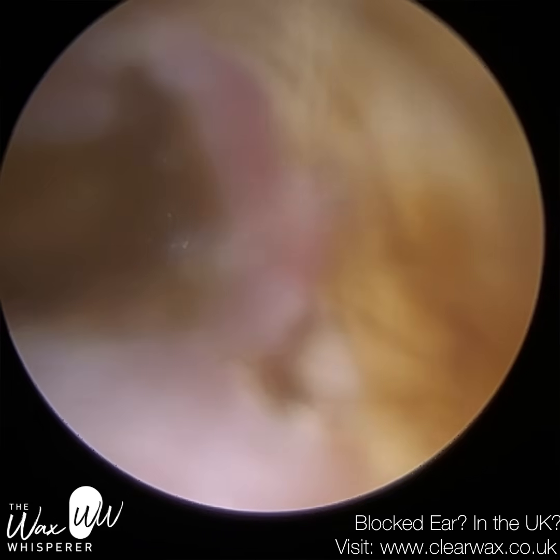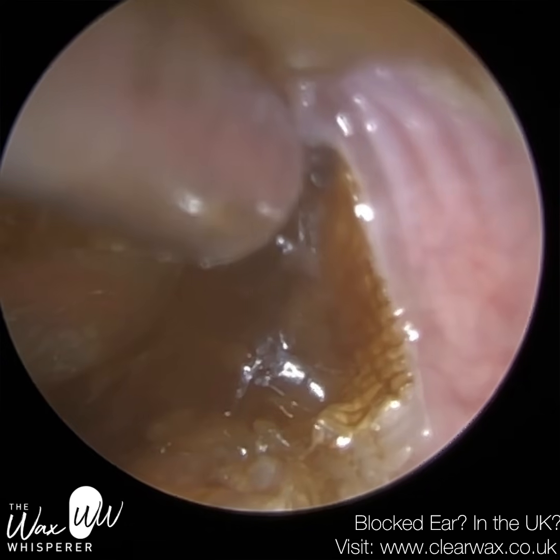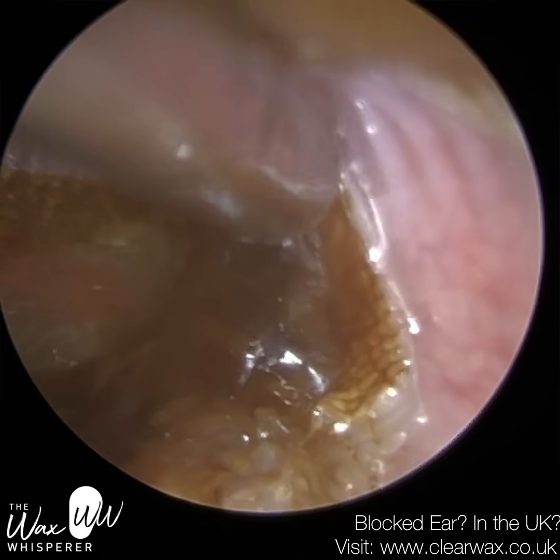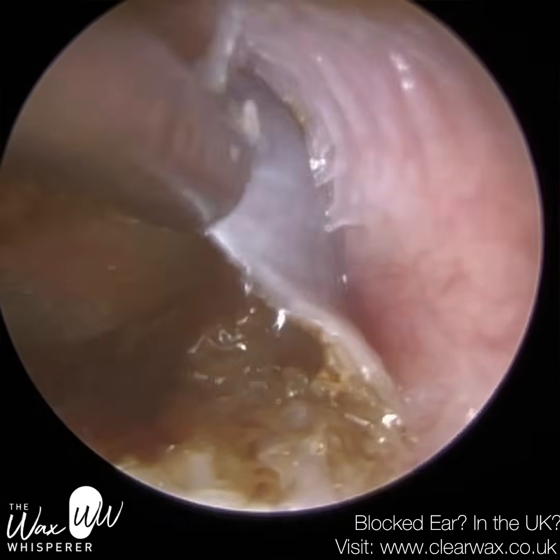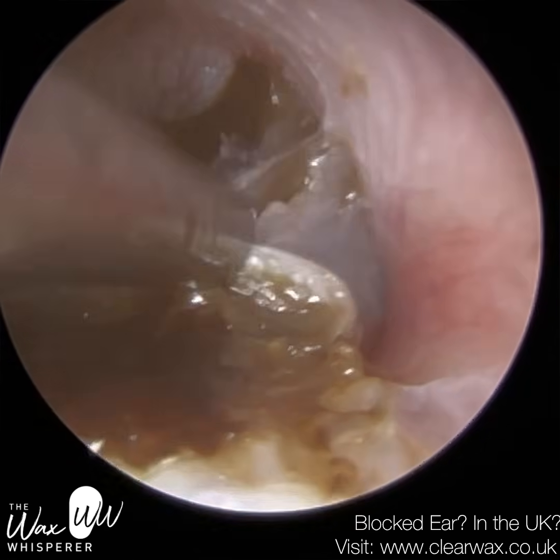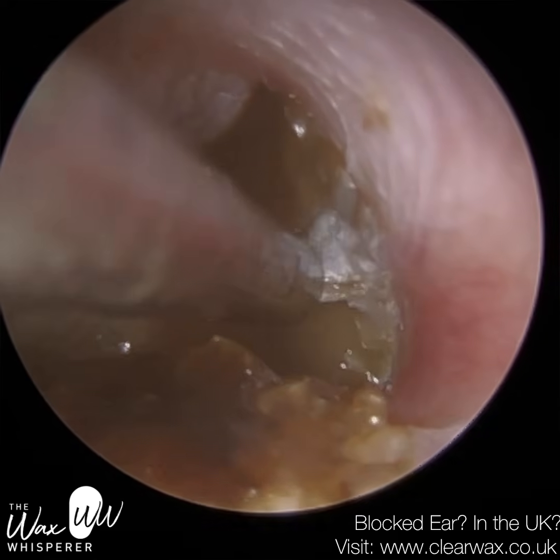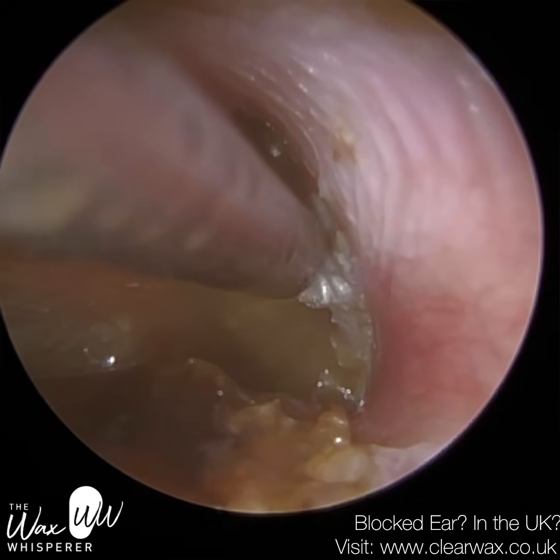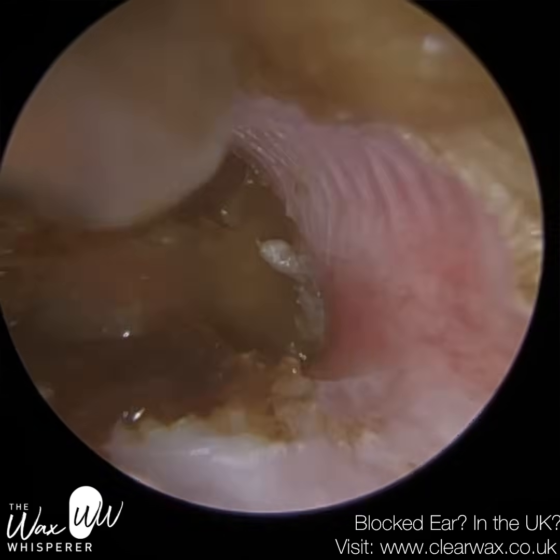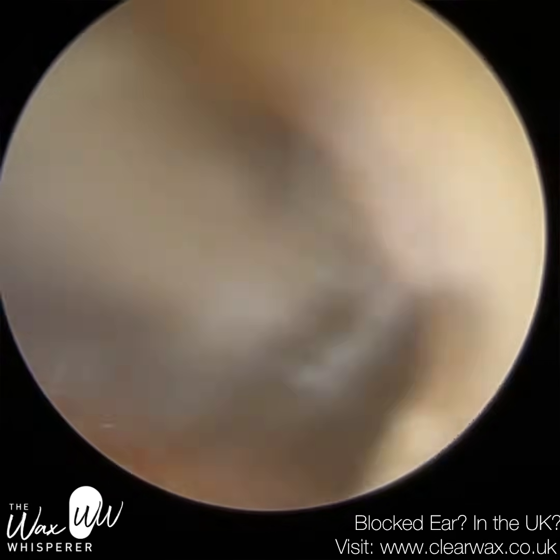And this skin is also lined on the eardrum, so if you continue to watch, you'll see me also peel it off the eardrum. Now, one of the other potential causes as to why this patient's developing this otitis externa, other than their eczema, is that they have a sensitivity to sound. And upon questioning and learning more, this patient is suffering from a condition called superior semicircular canal dehiscence. And in that condition, which I'll briefly explain in a moment, you can get sound-induced vertigo or pressure-induced vertigo, and the patient suffers from both.